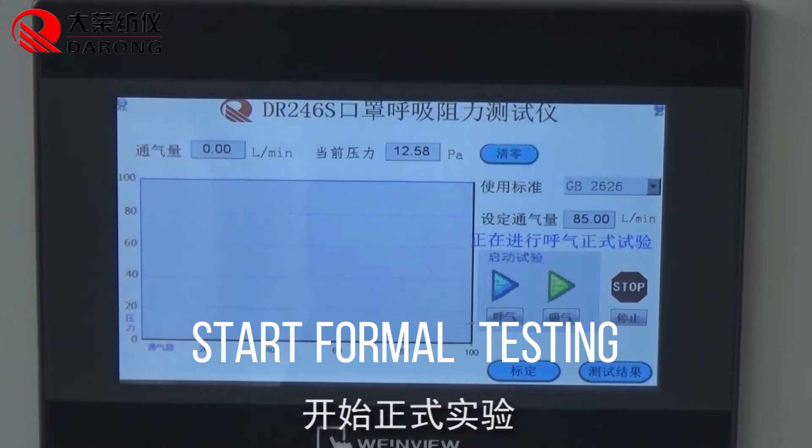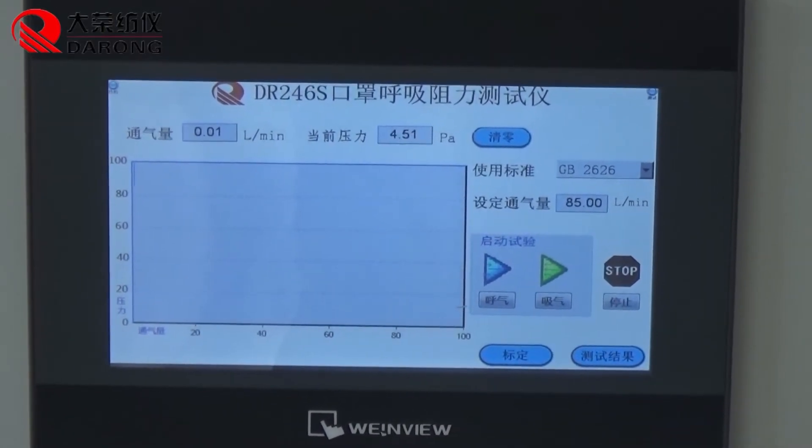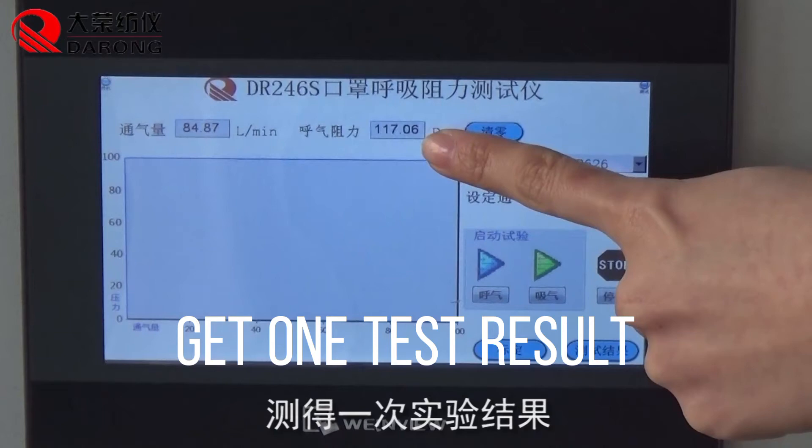Start formal testing. This will get one test result.